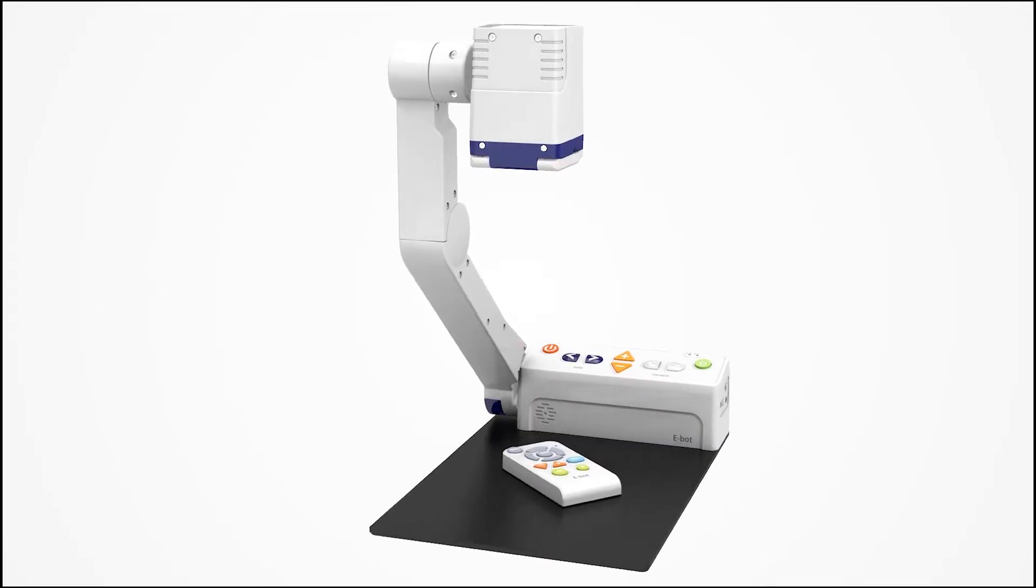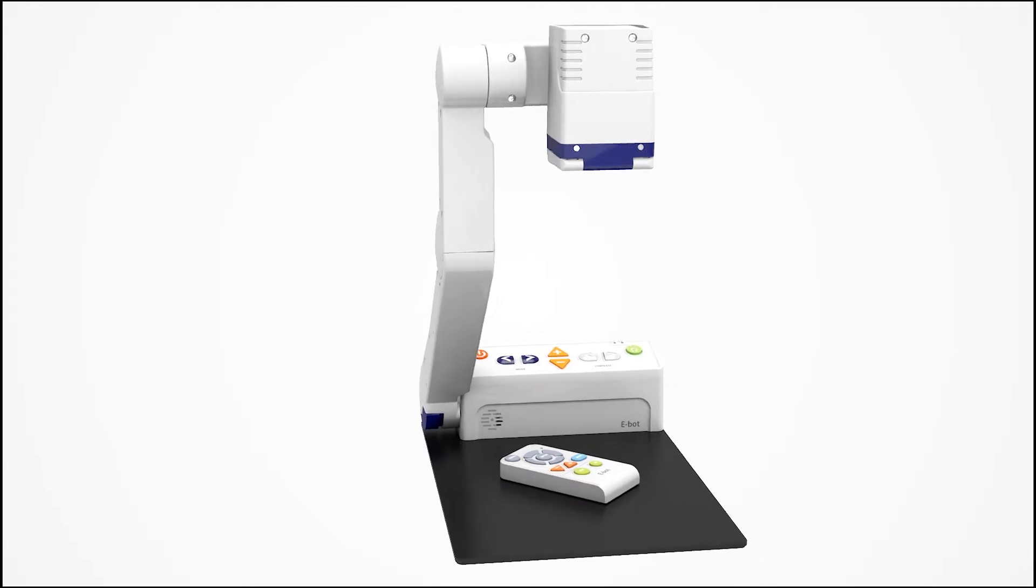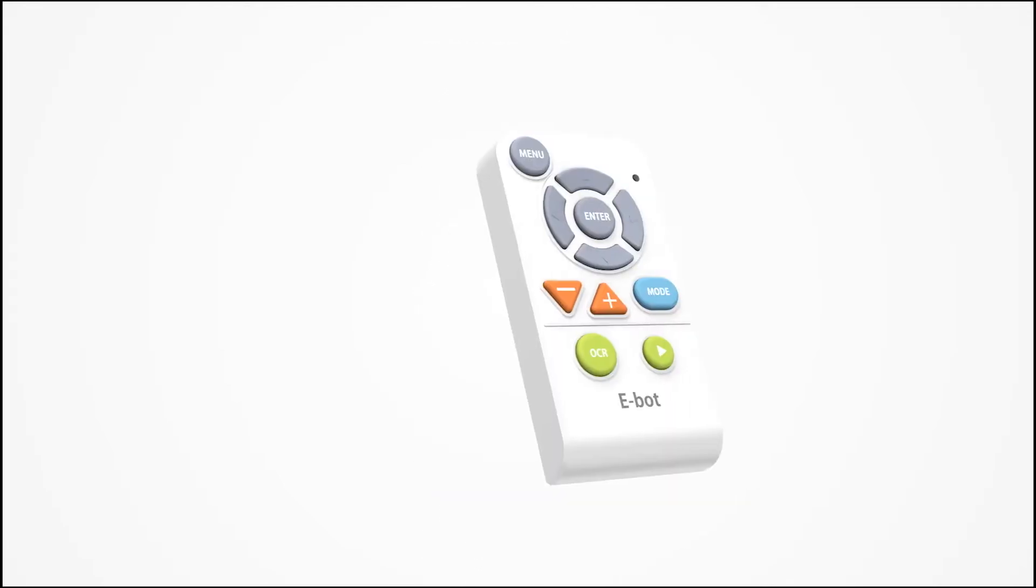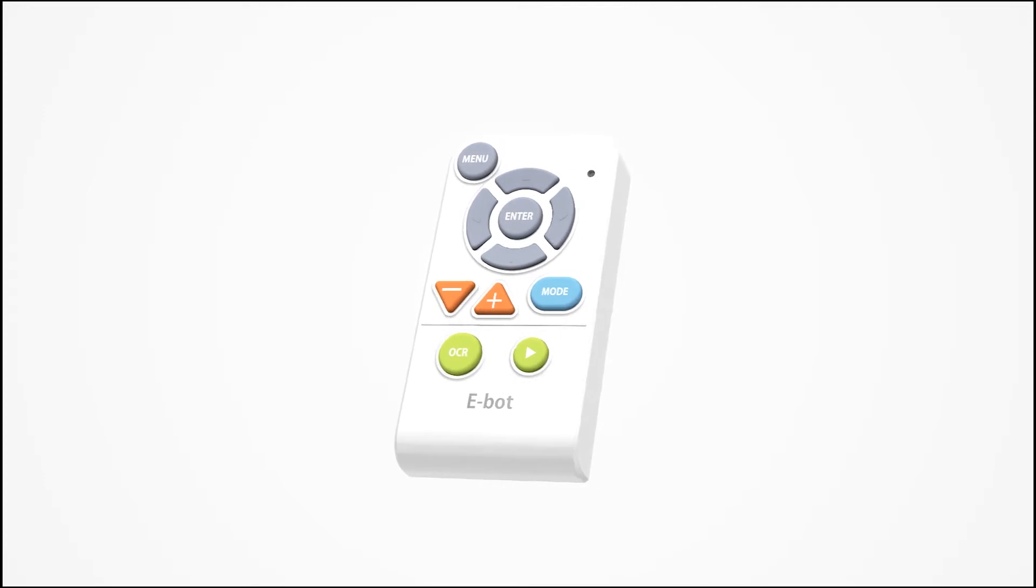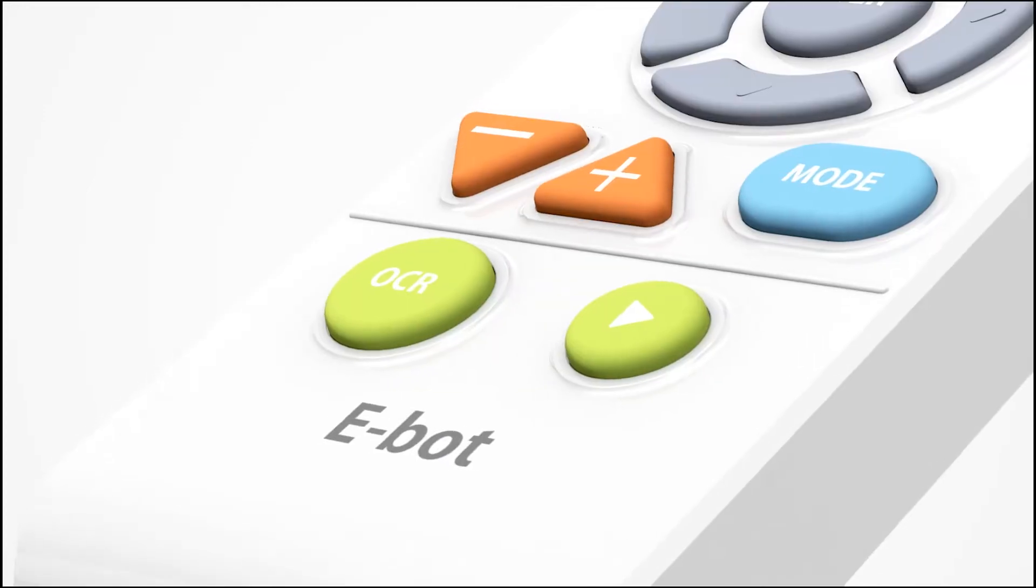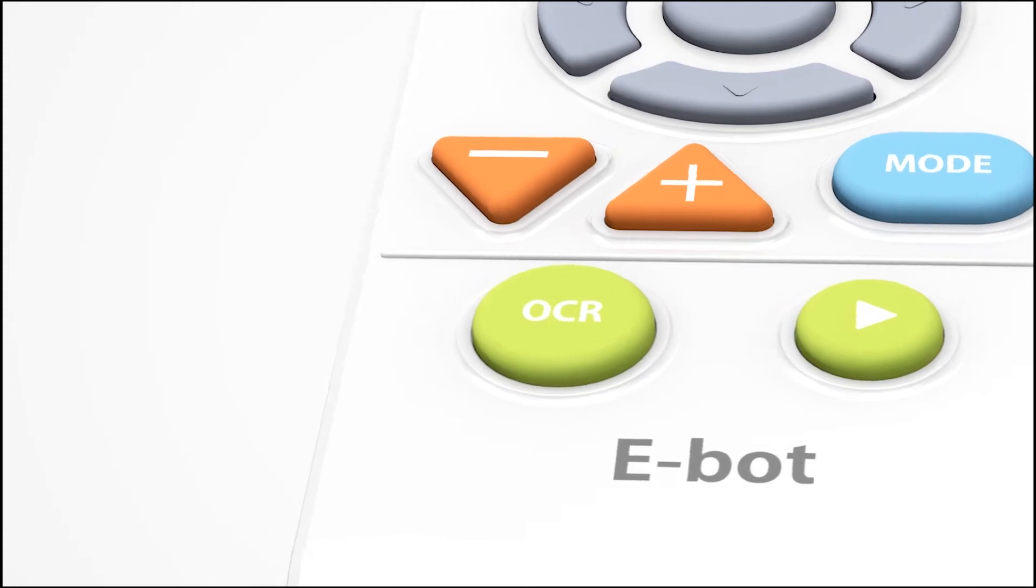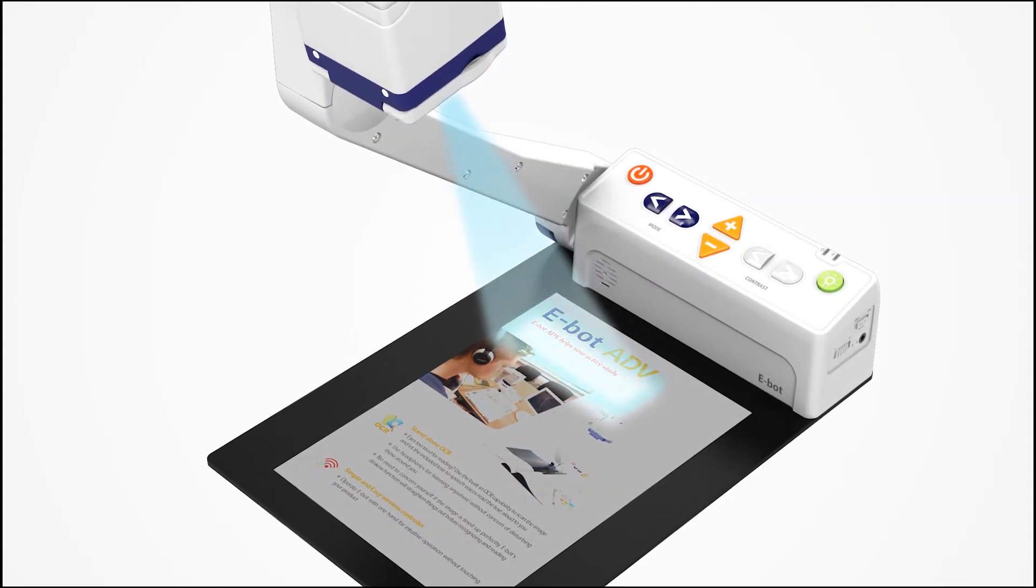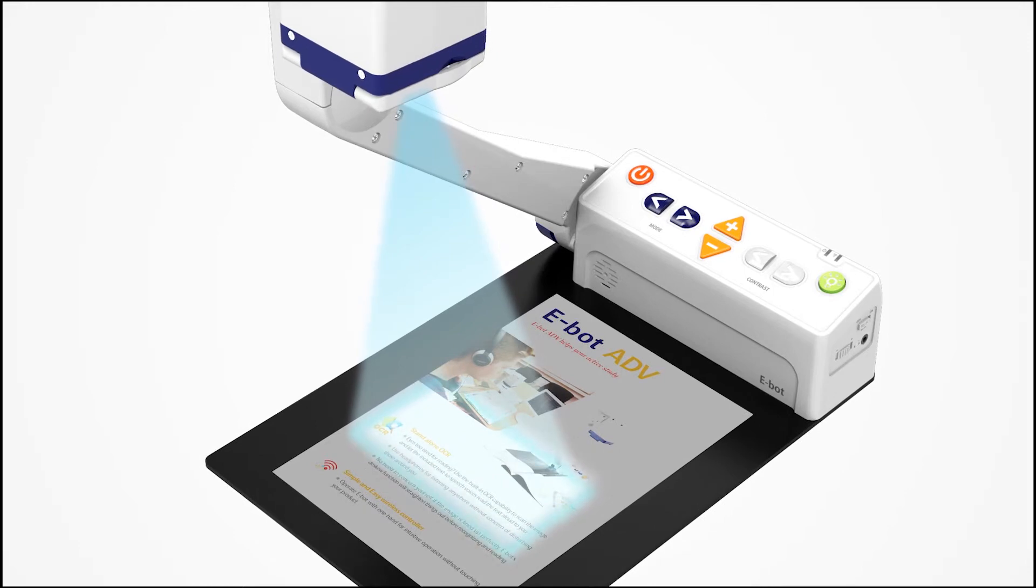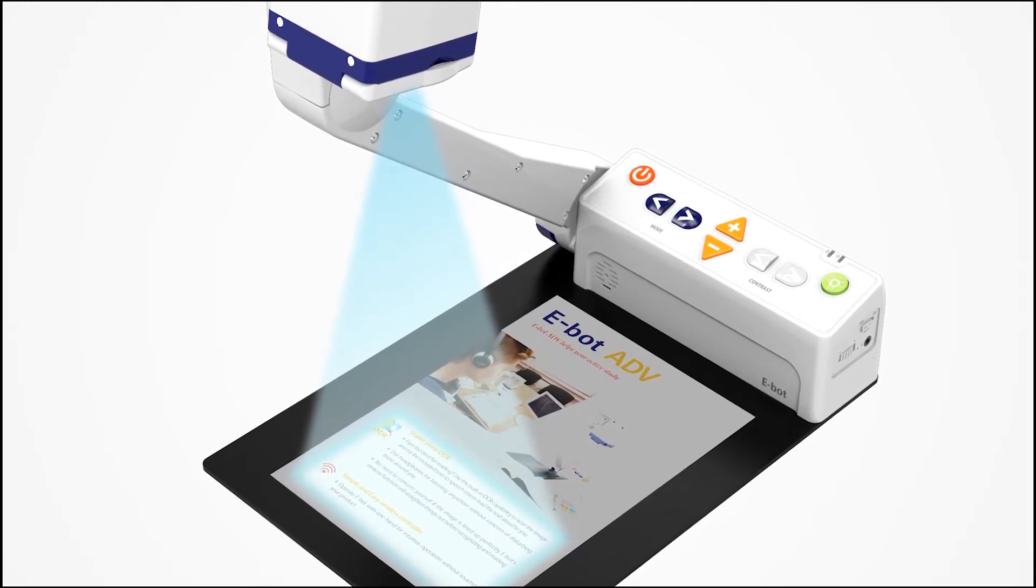eBot Advance provides audio and visual feedback at the same time through its state-of-the-art optical character recognition function. When the OCR view button is pressed, the page under the camera is quickly scanned, precisely converted to text, and read aloud to the user.